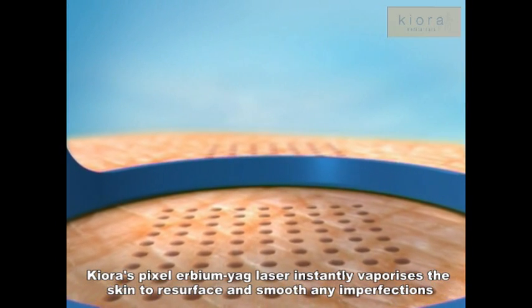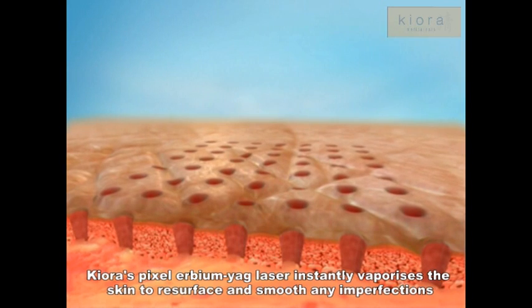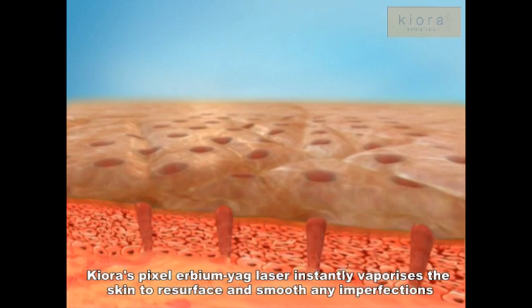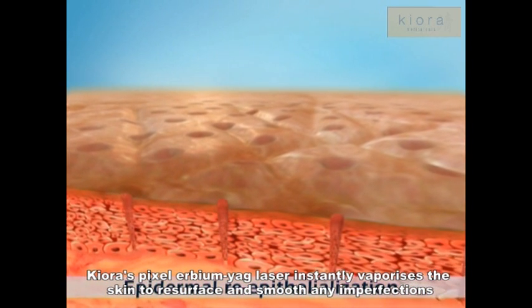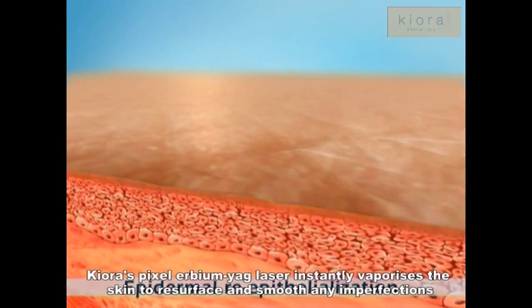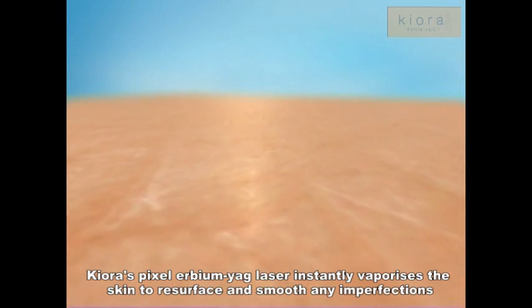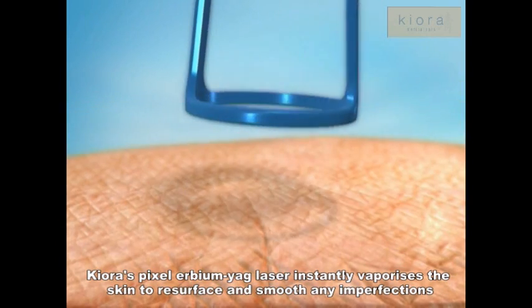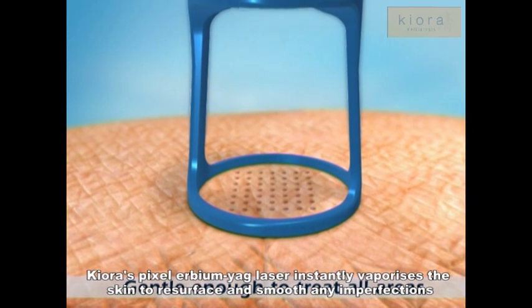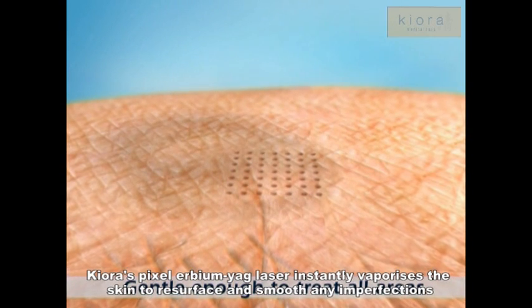The result is superior skin resurfacing. The intact, uninjured skin surrounding each pixel point provides a short migration path for new, viable epidermal stem cells, facilitating rapid wound healing and growth of new epidermal cells. The result is smoother skin and a refreshed appearance without the inconvenience of downtime. Since only a fraction of the treatment area is affected, delicate skin areas such as the neck, chest and hands can be easily treated.